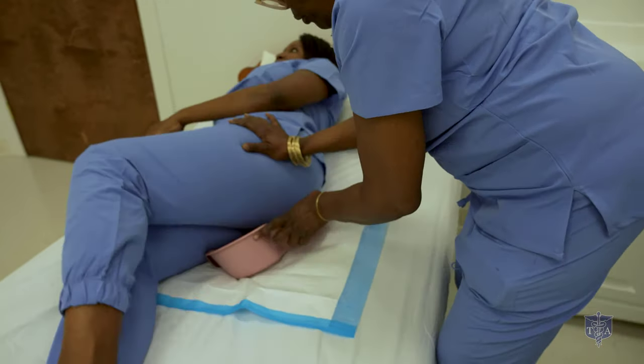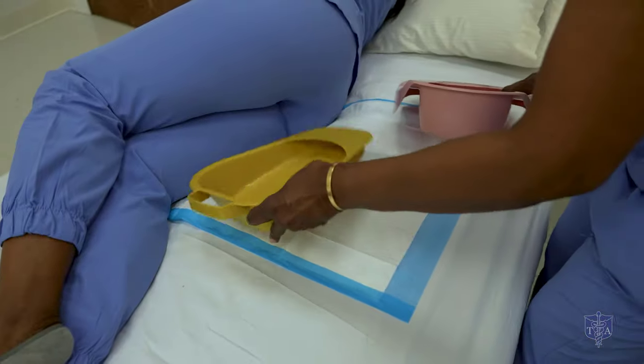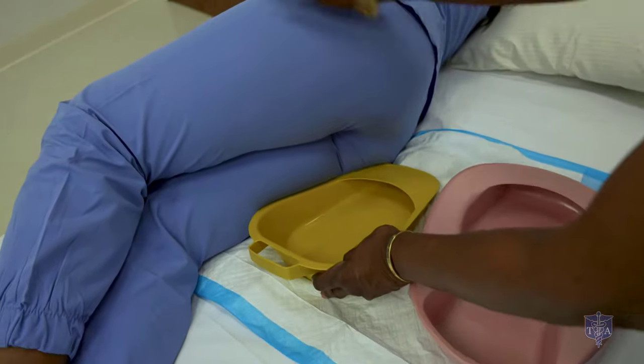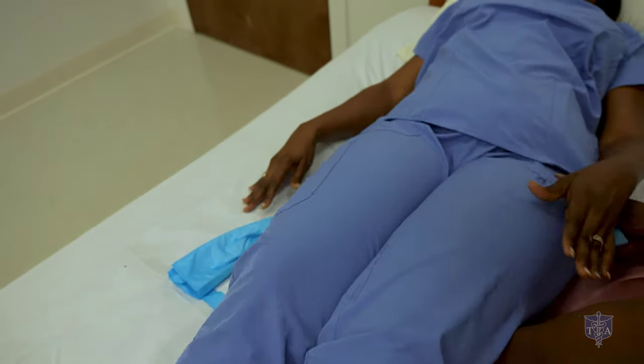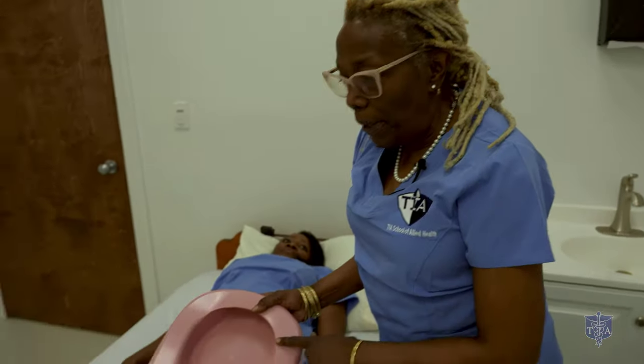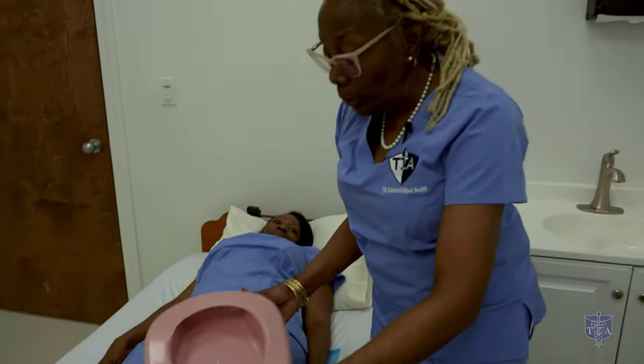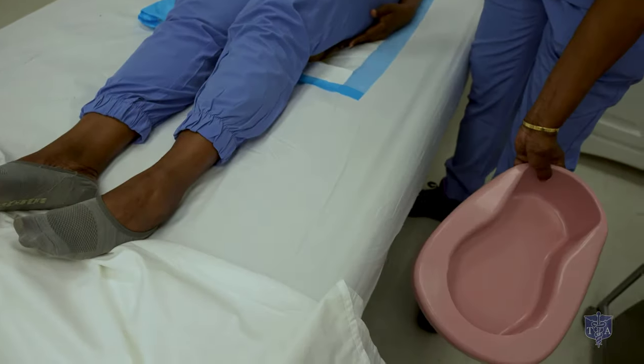Now the use of the fracture bedpan: the fracture bedpan is used like so — slide it this way, and she can roll back onto the bedpan. What we need to remember as nurses is that the bedpan can never go on the bedside stand, ever — nor can any urinals. You can place your bedpan here on the chair or on the floor.